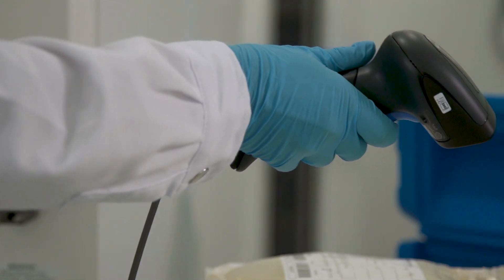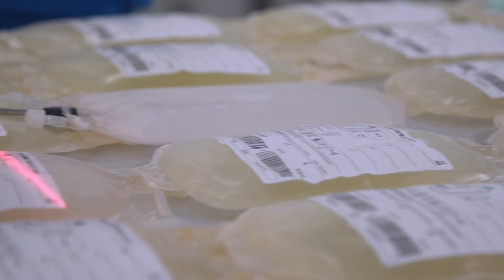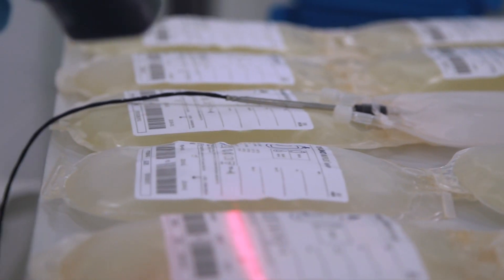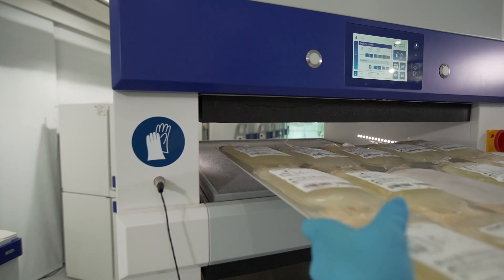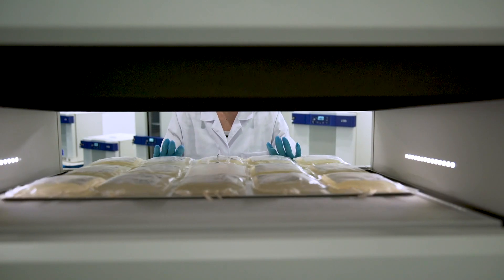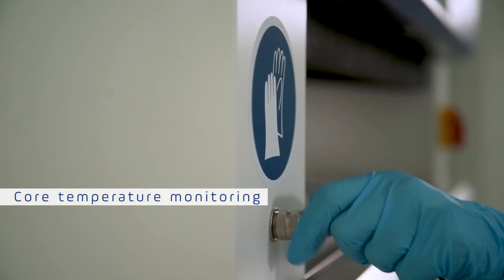Always start loading in the centre of the plate. The bags shall not overlap each other, but freezing in double layer is allowed. Once the freezing plate is ready to operate, place the tray inside the CSF. If you want to monitor the temperature of your bags during freezing, don't forget to connect the dummy bag.